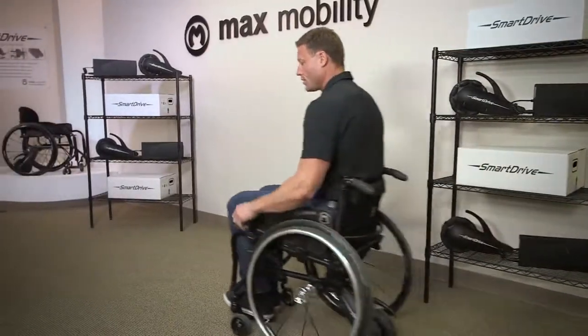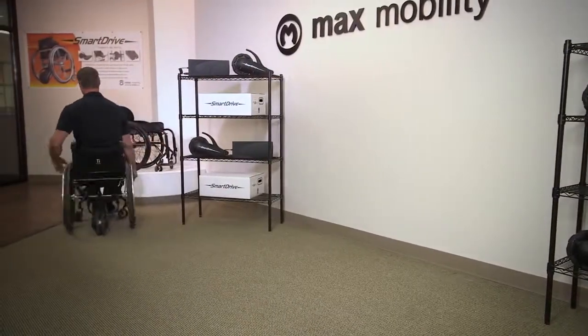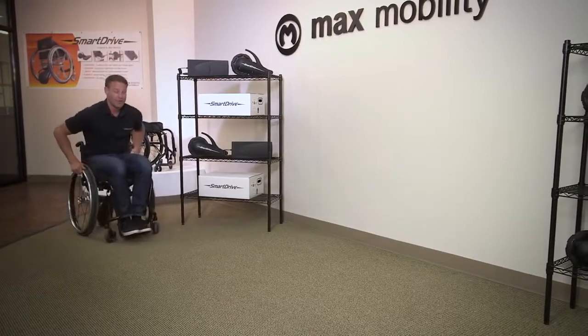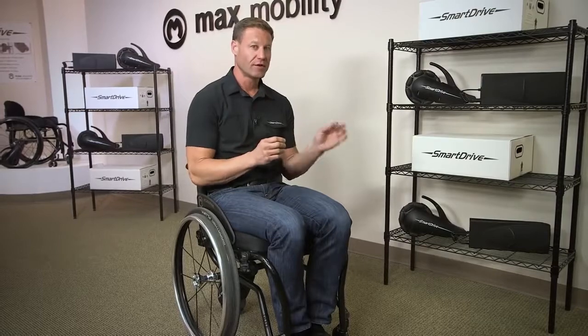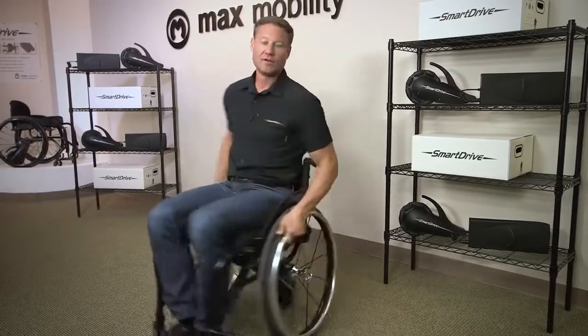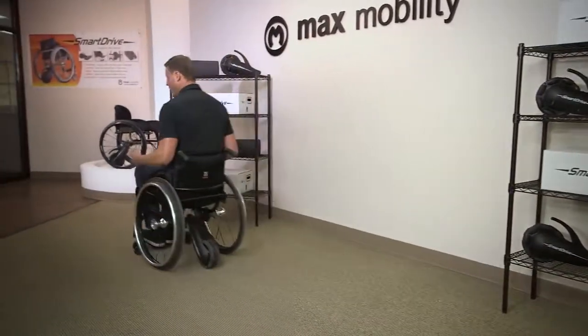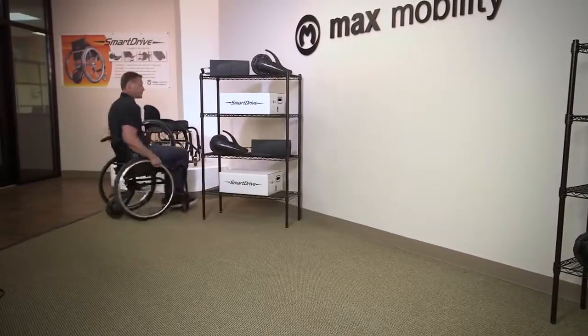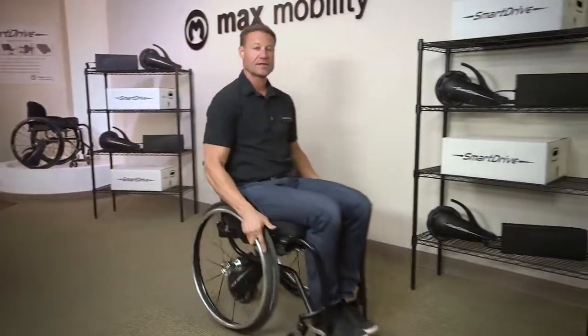So, push slow, the motor turns on, and it drives at that speed until you press the button to turn off the motor. And again, push fast, and it will go fast. You can also build up speed, start slow, and work your way faster. You just need to leave a little bit of time for the SmartDrive to get to each speed before you take your next push. So in this case, we can push slowly, get it going slowly, then push faster, and it'll go faster. So you can work your way from slow to fast speeds very easily.